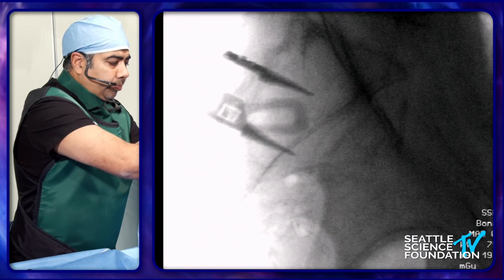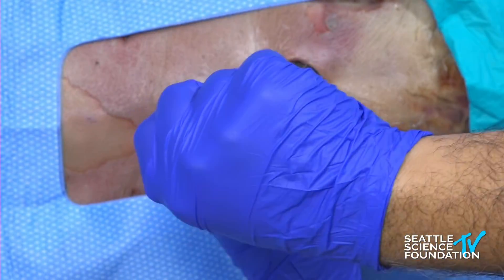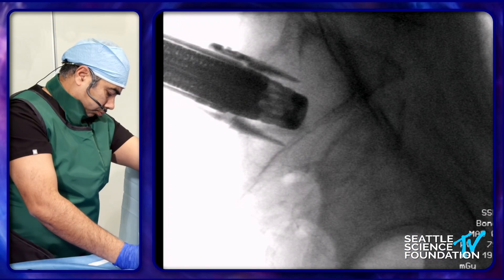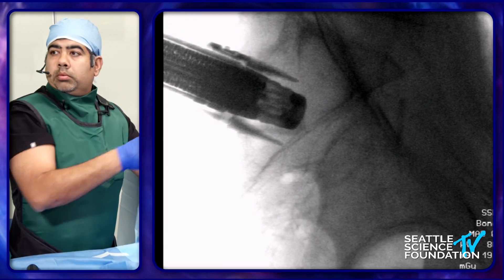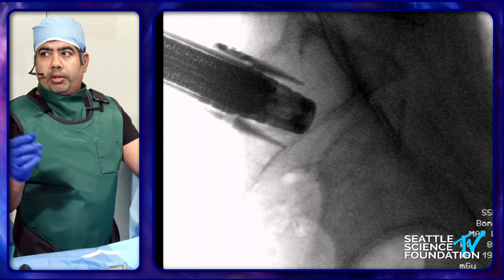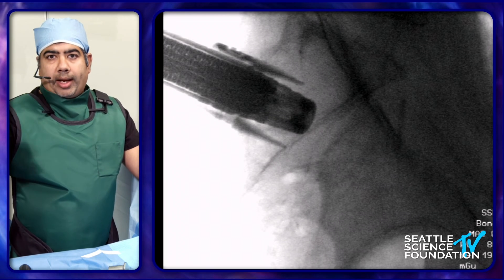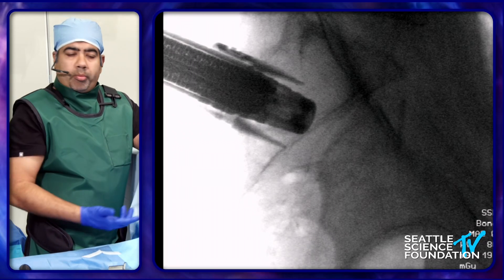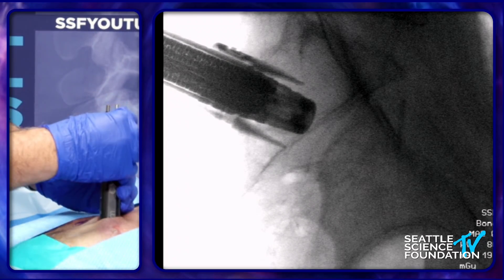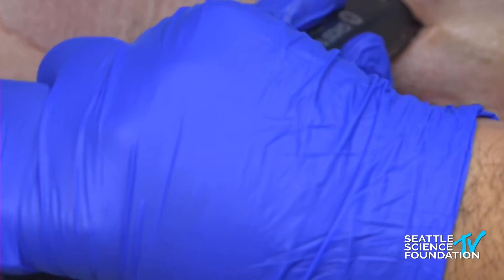There's only one way this goes, and you have a hammering cap which you can insert on the hammer. The way this implant is designed — as you'll see on the lateral X-ray — there's a head which rests against the posterior line of the sacrum, or the sacral shadow, and that implant is basically within the joint. For the screws: you have the sacral screw — go ahead and leave about a thread there — that's counterclockwise.